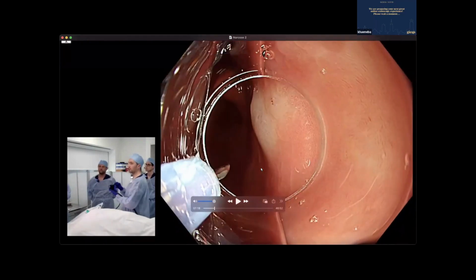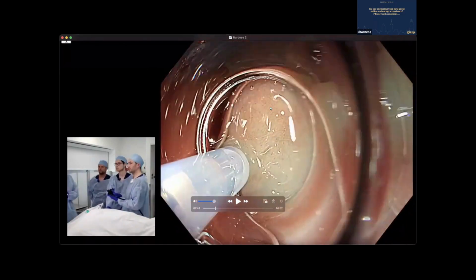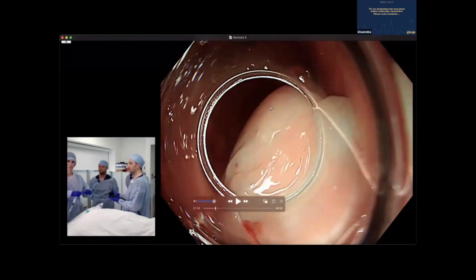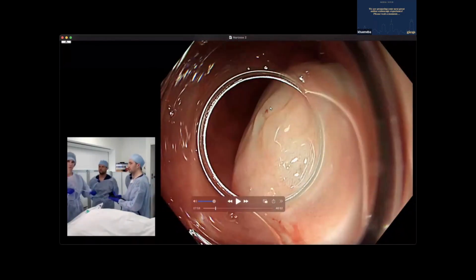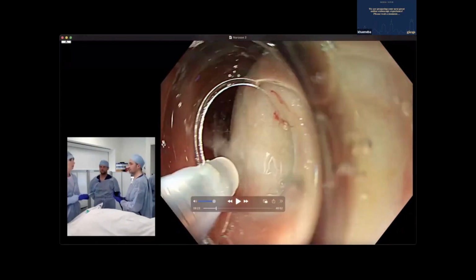Actually, I think at one point I was trying to, yeah, the injection wasn't working. It was giving repeated intramucosal injections. How did I solve that? Got someone to hold the scope, got into a better position, got a better lift, but not in the same place, actually. Something wrong with the mucosa in that. Made me have to go a different direction when I got in there, but okay, it was doable.